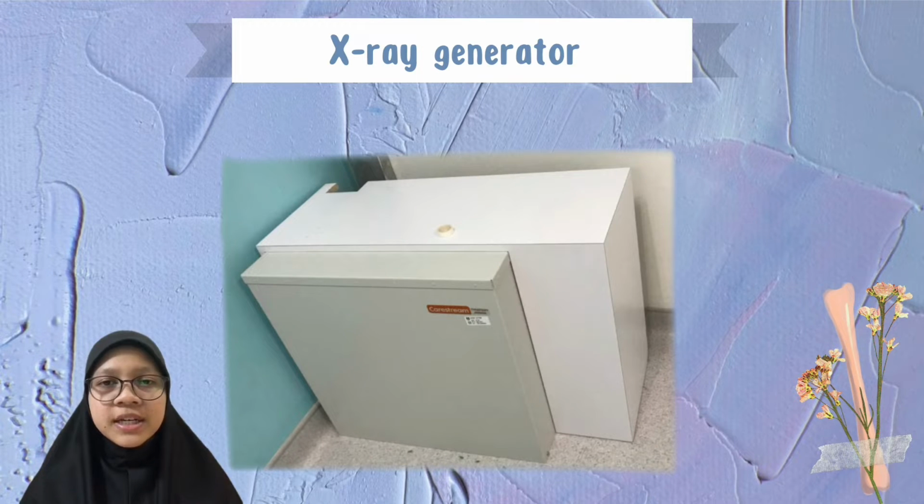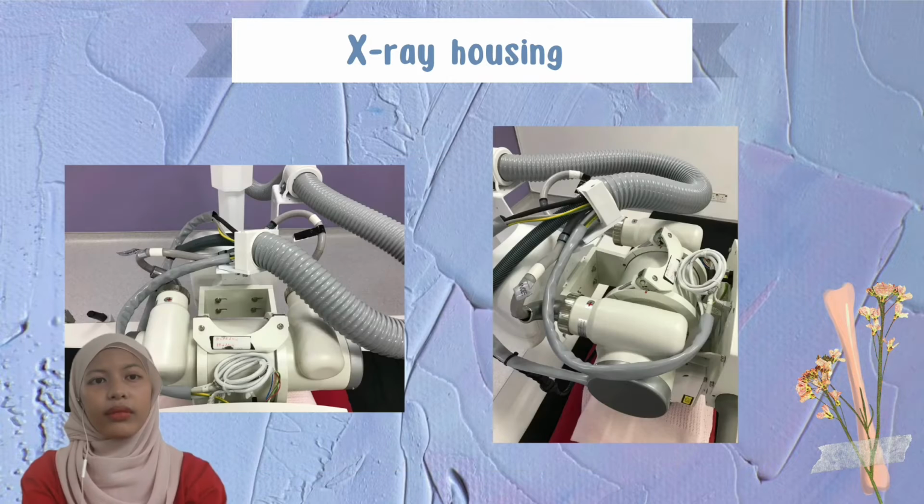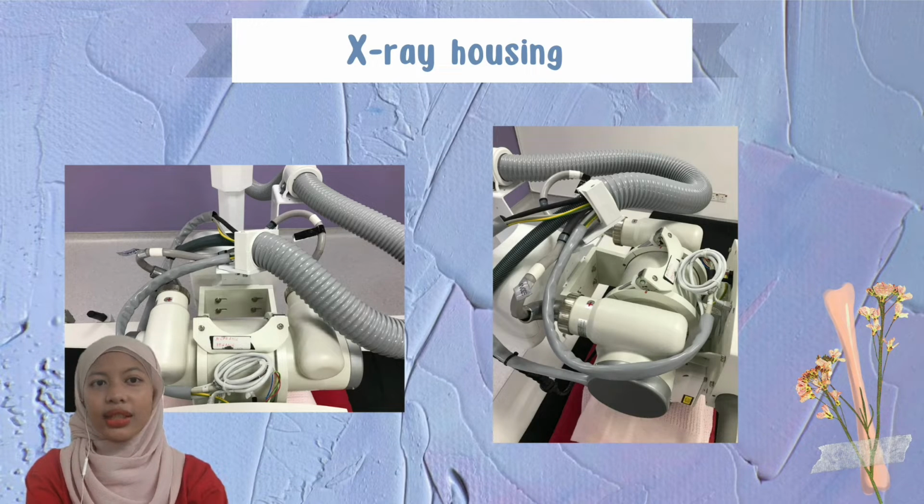The X-ray generator delivers the electrical power to energize the X-ray tube and permits the selection of X-ray energy, quantity and exposure time, and the dissipation rate specific to a generator and X-ray tube target and housing. The X-ray housing is needed to protect the outer space from the leakage of radiation.